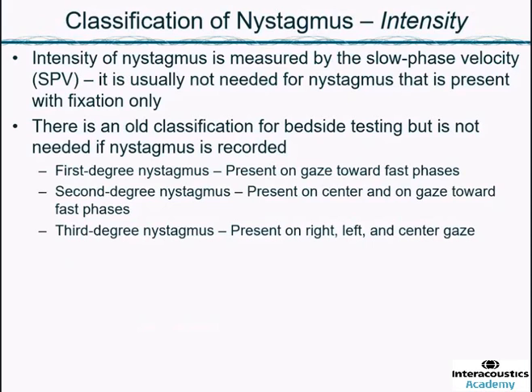That directly relates to the patient's symptoms, that directly relates to how much activation of the vestibular pathways the patient is experiencing. The other parameters that are used sometimes, like frequency and amplitude, do not have this feature. So back to what we're discussing here.